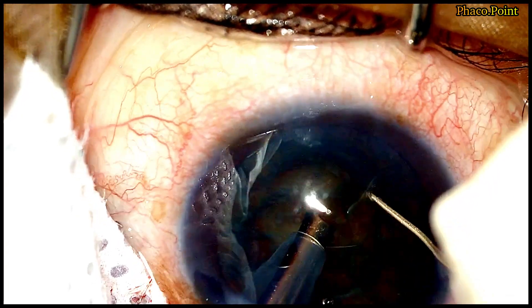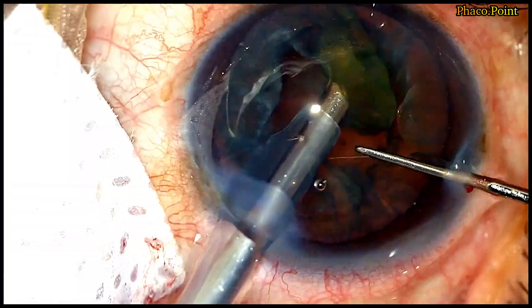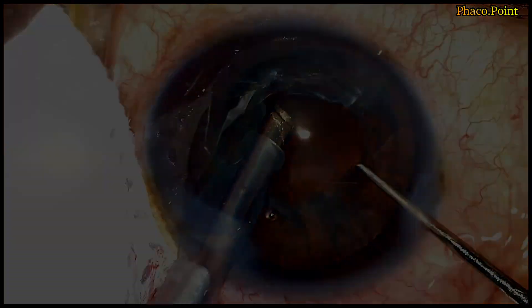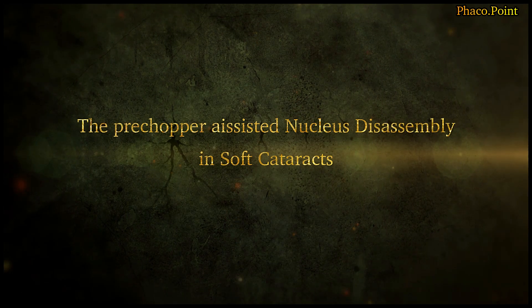So what if there could be a simpler way in which we could actually break this nucleus into four smaller emulsifiable fragments? Let's see in the following few cases how the Mohanta pre-chopper actually helps us facilitate a division of the nucleus into small viable fragments with significant ease.